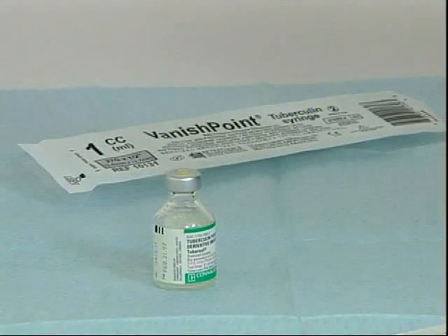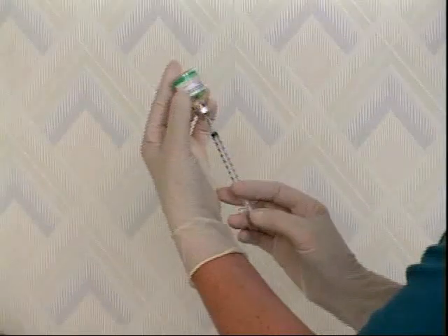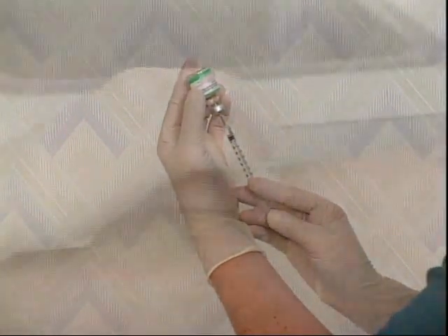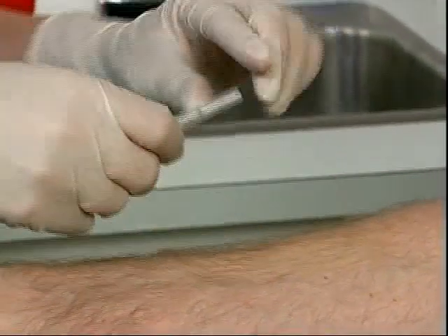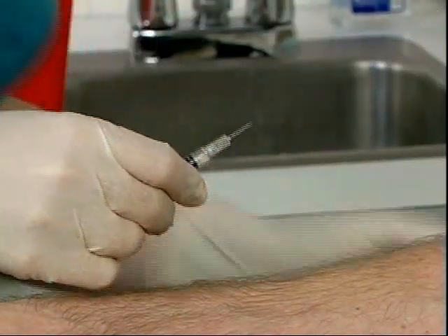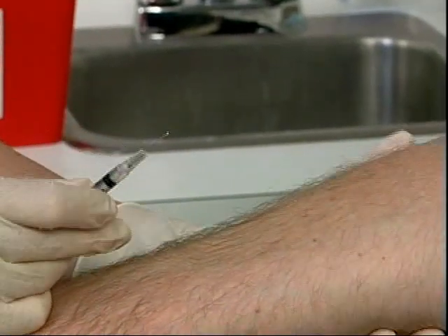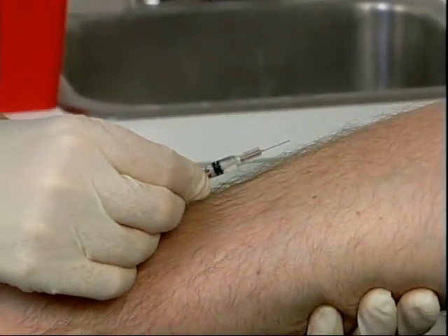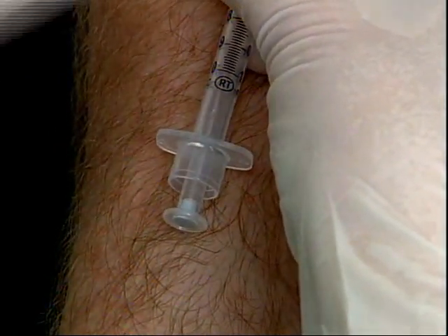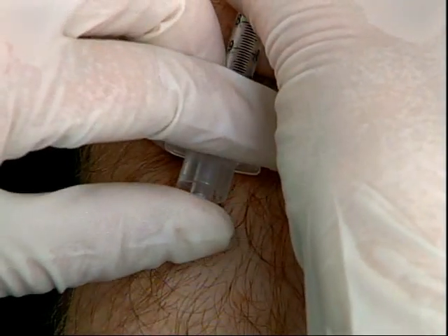VanishPoint syringes are ideal for intradermal injections, such as TB skin testing. The integrated safety design has no added-on components to get in the way. This allows VanishPoint syringes to achieve the low angle of insertion necessary for intradermal injections. Just as with subcutaneous or intramuscular injections, fully depress the plunger using your thumb to squeeze through the slight resistance point to activate the automated retraction while the needle is still in the patient. The needle will automatically retract and is safe for disposal.